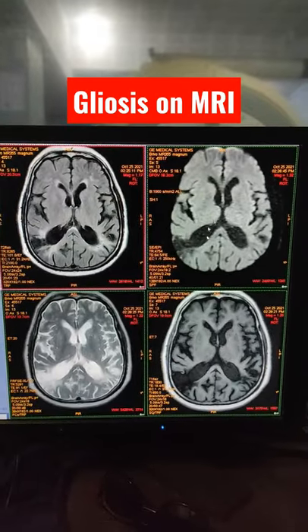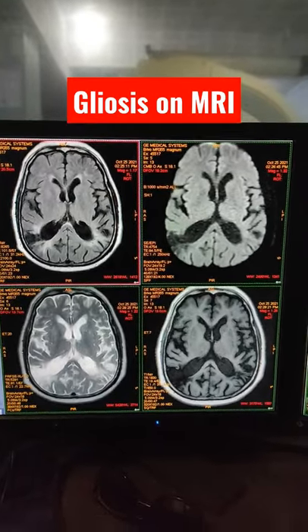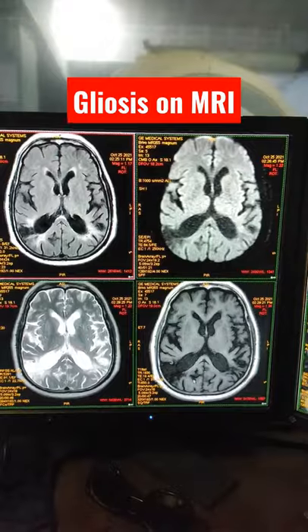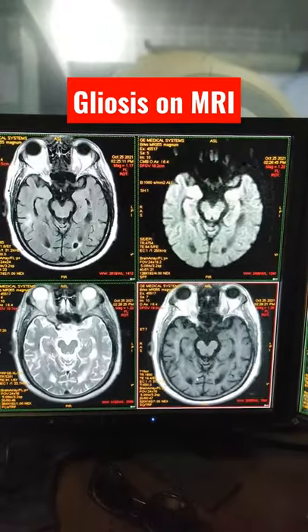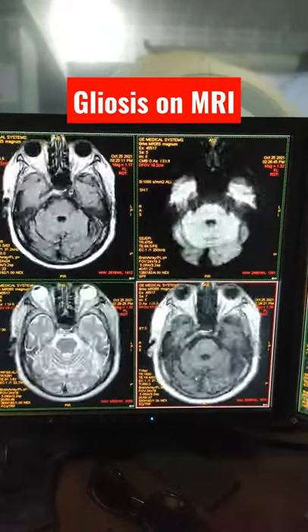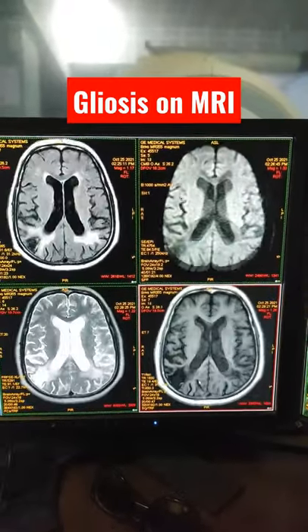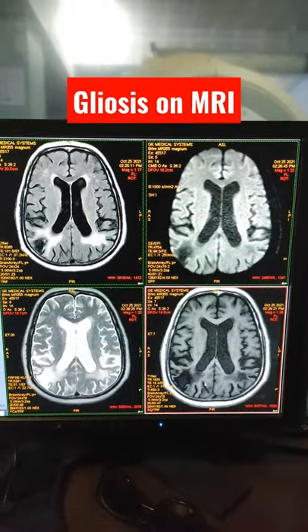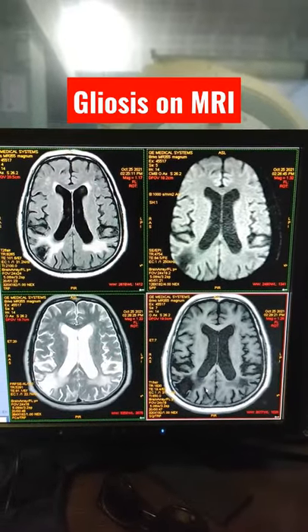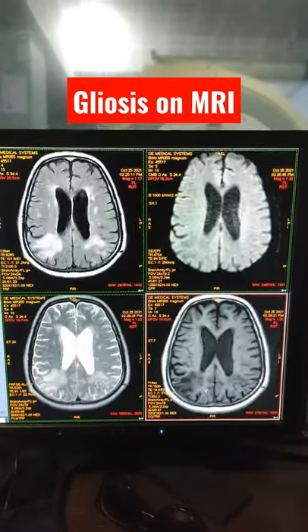This one is FLAIR, this one is diffusion, this one is T2, and this one is T1. This is how a gliotic area looks.